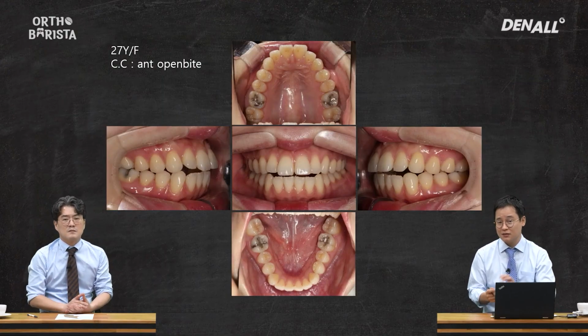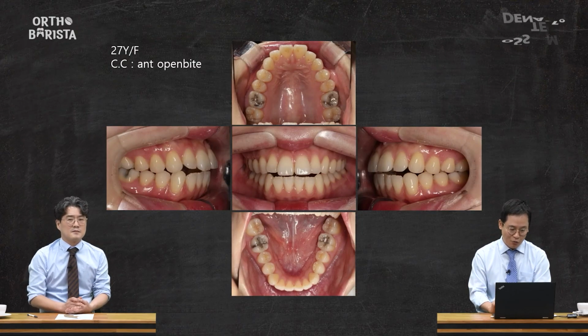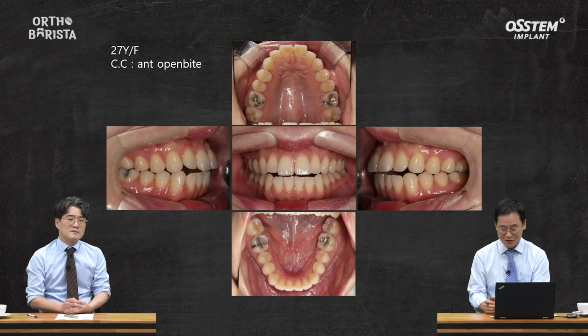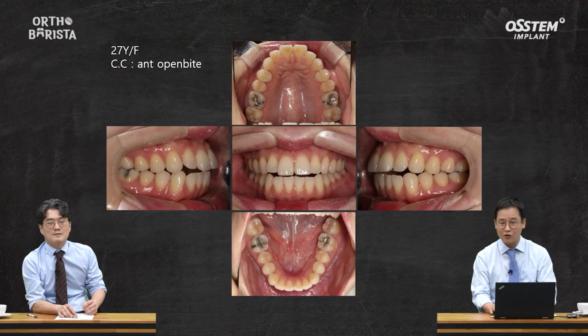But retention is an issue not only in clear aligners but also in bracket-based orthodontics. There are actually no studies suggesting that the possibility of relapse is higher in clear aligners. Rather, there have been studies that relapse possibilities are similar in both treatment methods. Maybe I have some chance to go deeper about retention next year. Yes, hopefully. So it would be better for you to consider retention as well.